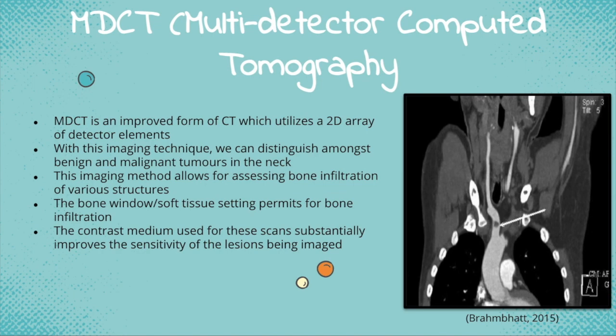400 milligrams of iodine are used for a neck CT. Since such a highly concentrated contrast is used for this scan, there is also a 5 to 10% increased contrast between the normal and the pathological tissue, which enhances the visibility and makes it easier to identify any diseases.